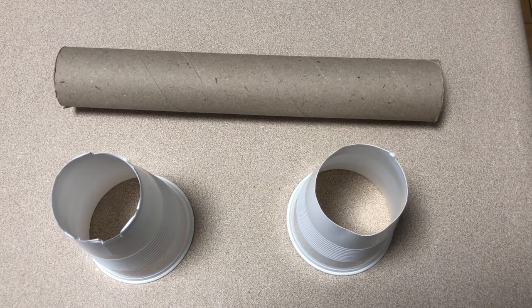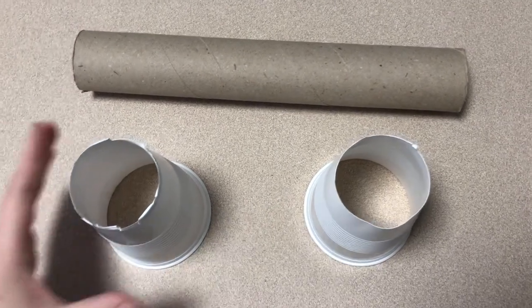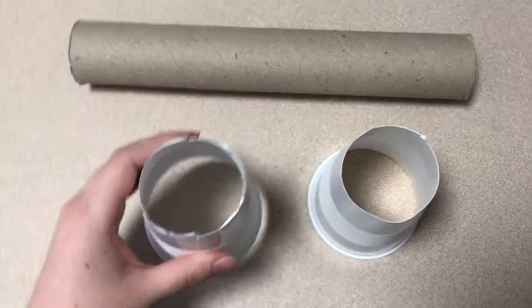Your first step is going to be cutting out the bottom of your two plastic cups gently with your scissors. Next, you're going to take one of your plastic cups and gently place it on the end of your paper towel roll.